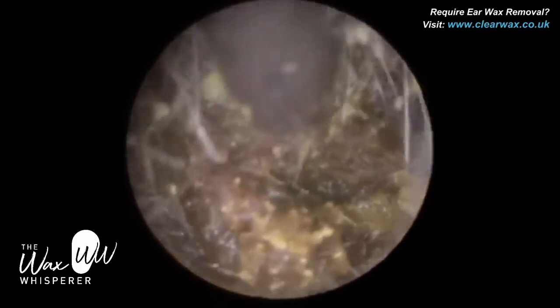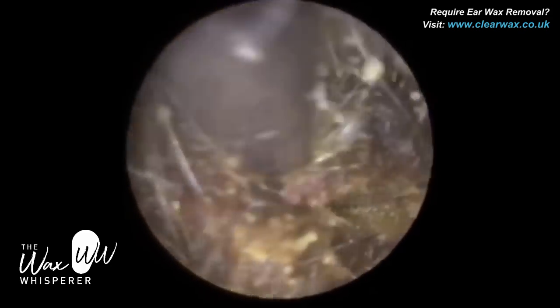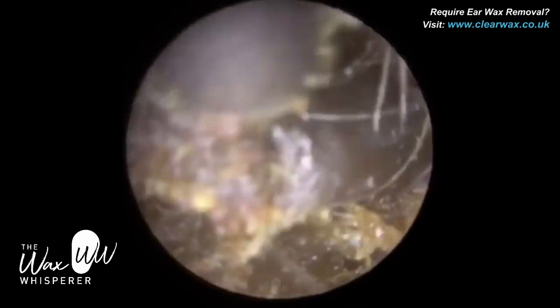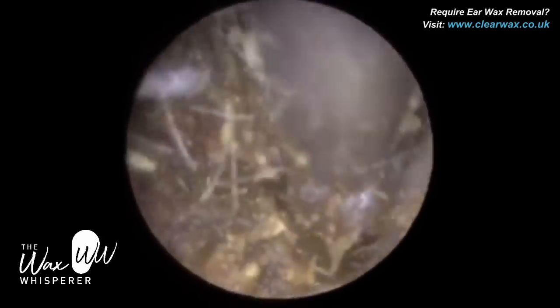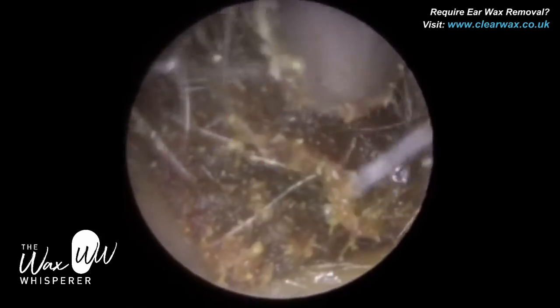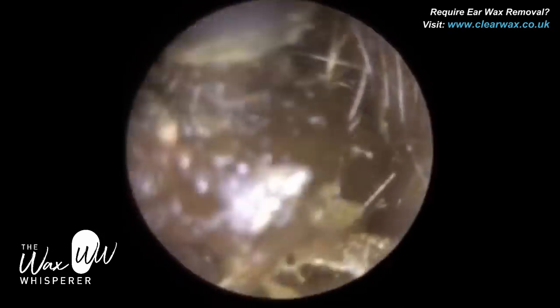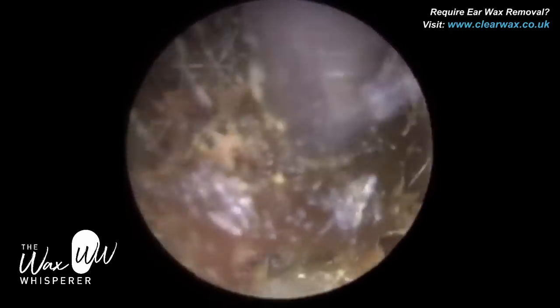Just trying to get a suction grip here because it's a bit stodgy and mushy. Sometimes it's a bit difficult, but slowly but surely — you can see what I'm doing. The posterior part of the plug of wax has a bit of keratin lining it; you can see the glossy appearance. That's just dead skin that's enveloped and engulfed itself around the plug of wax.